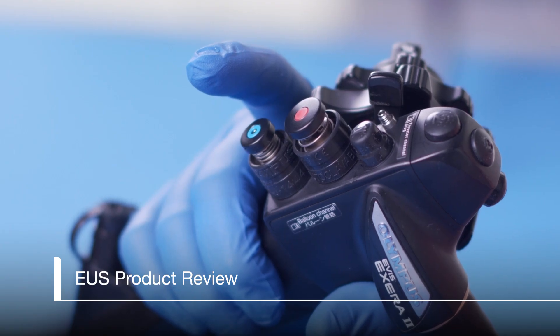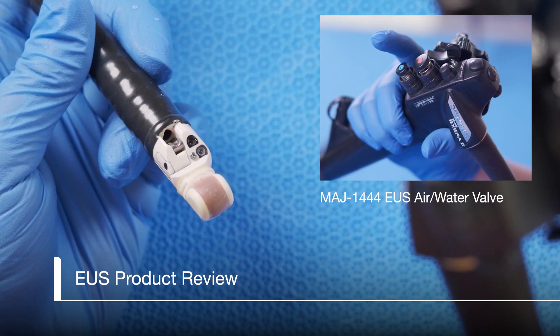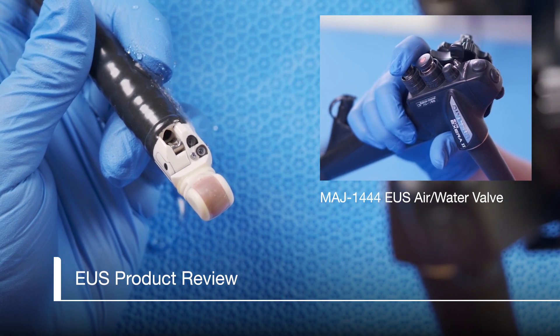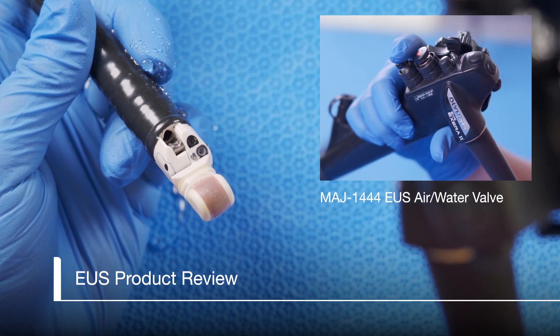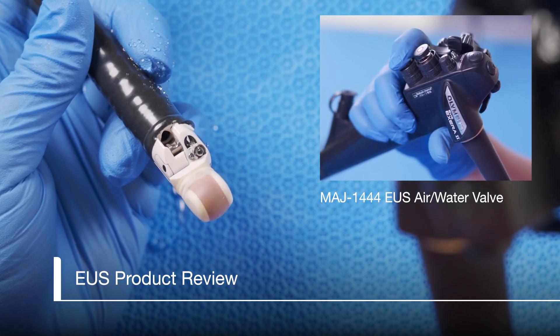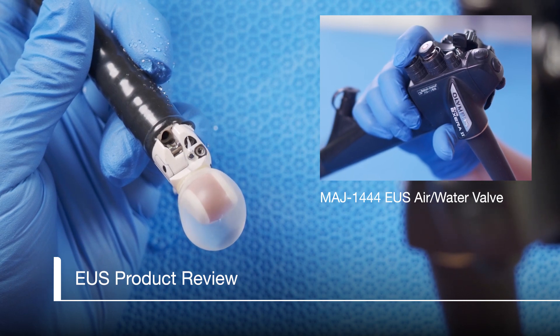For the MAJ 1444 air water valve, holding your finger over the hole in the center of the button and pressing halfway down to the first stage will activate the water jet to clean the lens. To dry the lens, release the button and cover the hole in the center of the button with your finger to allow air to be emitted. Covering the hole and completely pressing on the button to the second stage will fill the balloon with water.